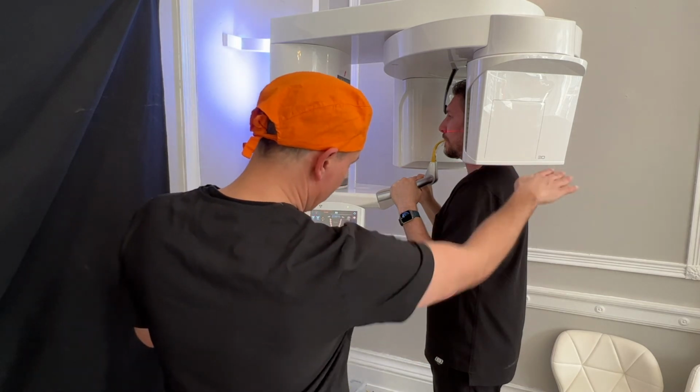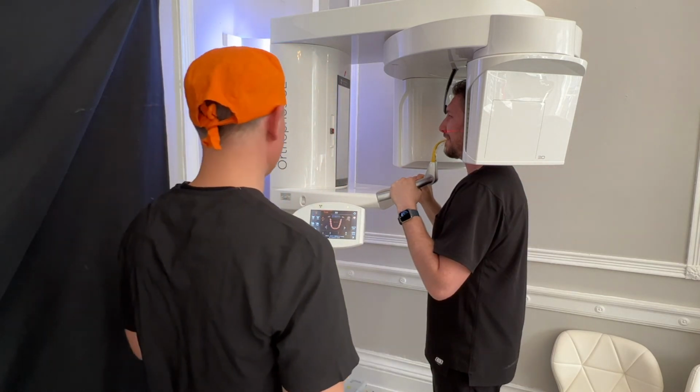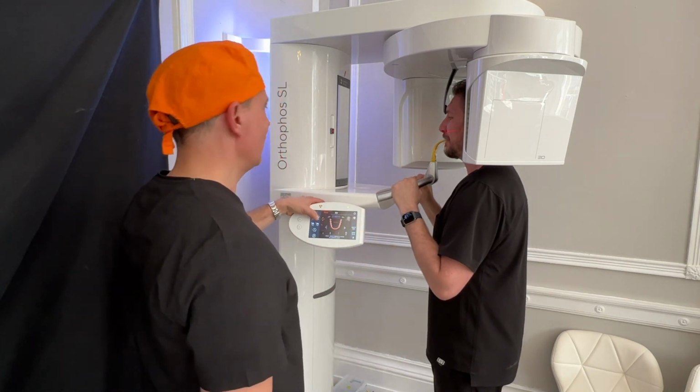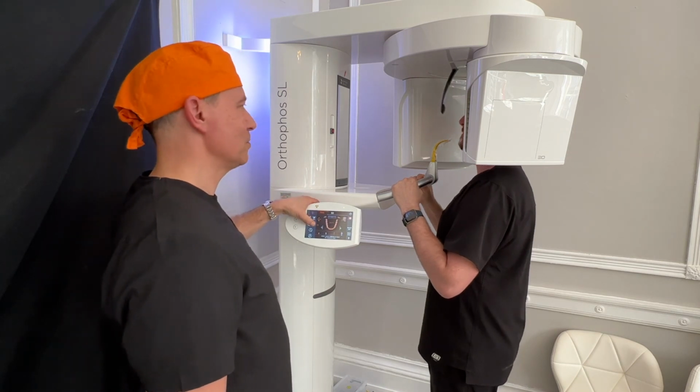Making sure that we have nice clearance here around the shoulders. I'm not going to take any pictures of you today, but there we are anyway. So that's how easy it is to set up an OPG. Thank you.